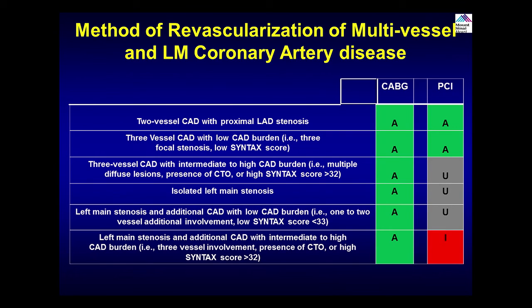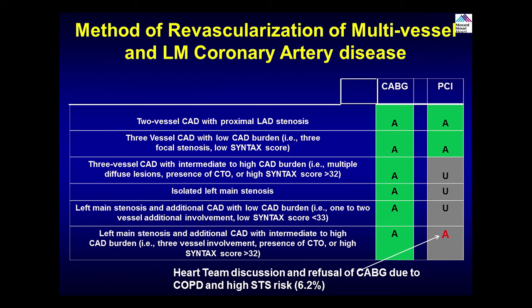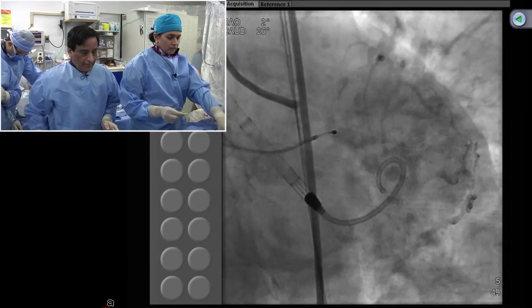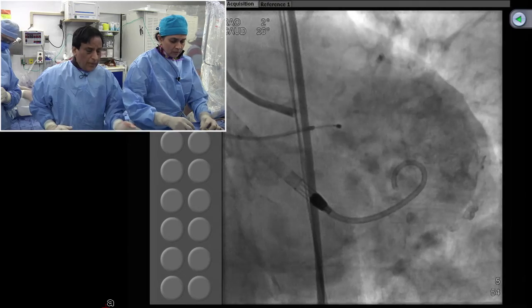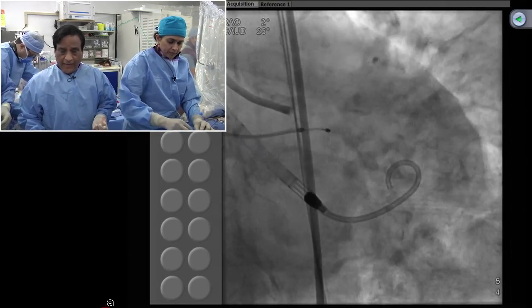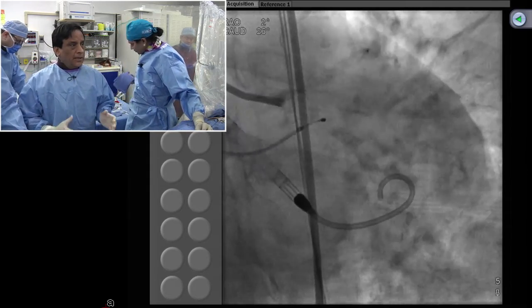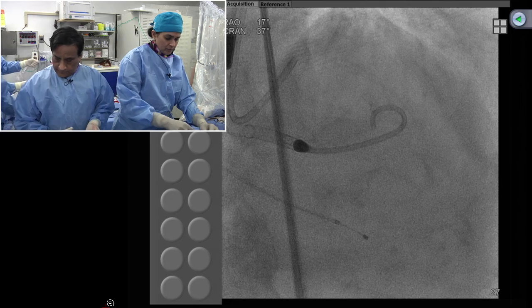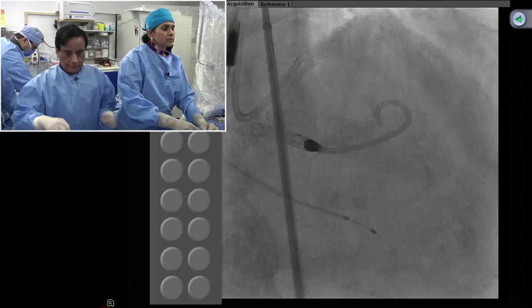One slide — PCI versus CABG: the key is that if you go by the guidelines it may be inappropriate, but we also know after the heart team discussion it is appropriate to do these cases because this patient otherwise viable has had a heart team discussion. So I call it appropriate, maybe rightly or wrongly, but the patient had a discussion to be taken care of the left main, LAD, and of course the RCA. The Impella has been inserted and the doctor is now putting up the rotor wire because of that extensive calcification.